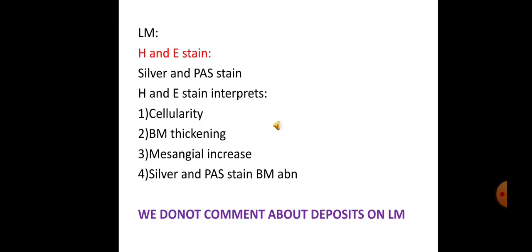Direct immunofluorescence in renal pathology. So coming to this topic, we discuss the findings on light microscopy, immunofluorescence, and electron microscopy.